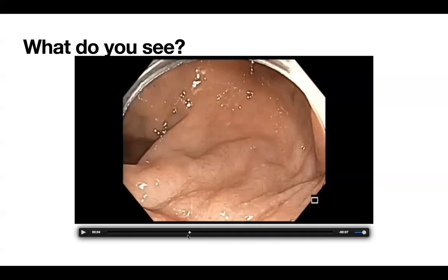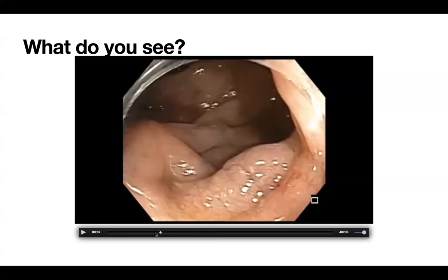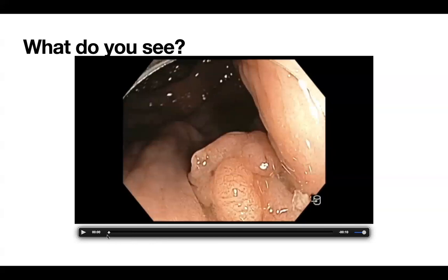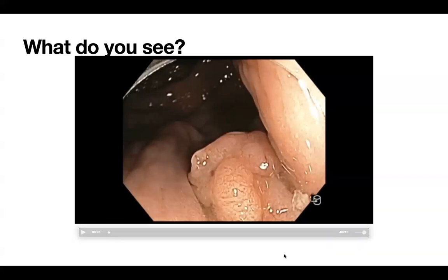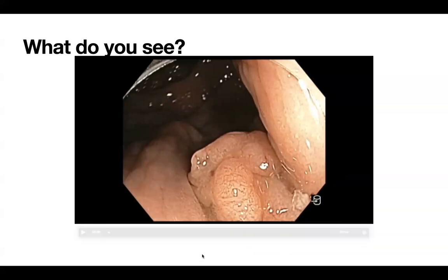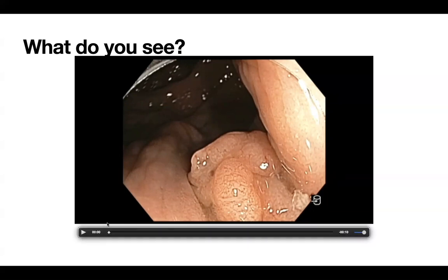And the polyp looks about 2.5 to 3 centimeters in diameter from the first look of it. Probably the morphology is tubulovillous. That particular area, we probably need to look at with NBI or spraying some indigo carmine or methylene blue to see more detail.